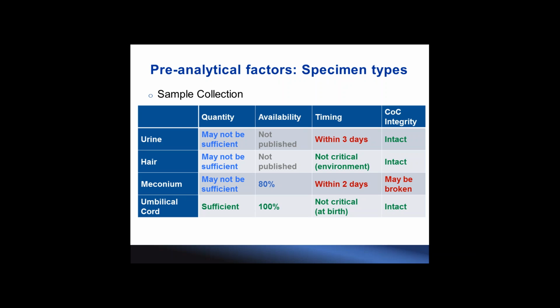Last but not least is the chain of custody integrity. In a few slides prior, I have shown you some boxes for the collectors to fill out each attempt. The collector gets the meconium samples before it's completed, and in that sense, it is a very high risk of breaking the chain of custody. We did some internal survey of the chain of custody forms and found that about 40% of the meconium samples that we received had more than 2 collection attempts.